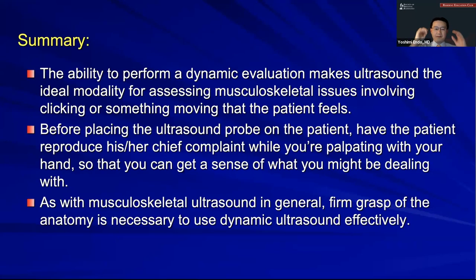All right, so hopefully I was able to show that the ability to perform a dynamic evaluation makes ultrasound the ideal modality for assessing musculoskeletal issues involving clicking or something moving that the patient feels. As I've already mentioned, before placing the ultrasound probe on the patient, you want to have a very brief conversation with the patient, see what the patient is here for, and make sure that the patient can reproduce the clicking sensation. I try to palpate what the patient is feeling, and I think that just makes the exam a lot easier and more reliable.